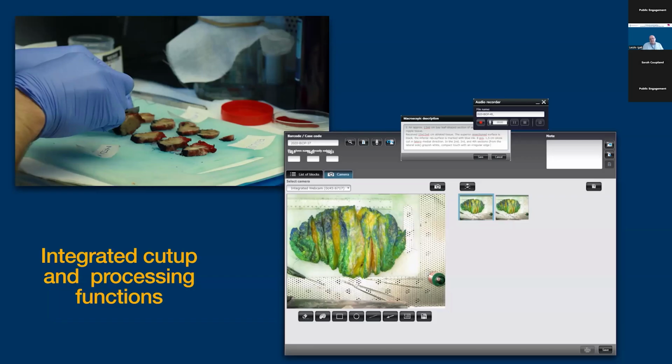And sometimes this is information of the grossing or macroscopic pathology image, also orientation of the blocks, the inking, everything. It's all needed, especially in today's world when sometimes the pathologist who is cutting up the material is not the one who is viewing the slides. And this new work enables us to look at the slides and the digital information from the cut-up room at the time of reporting.